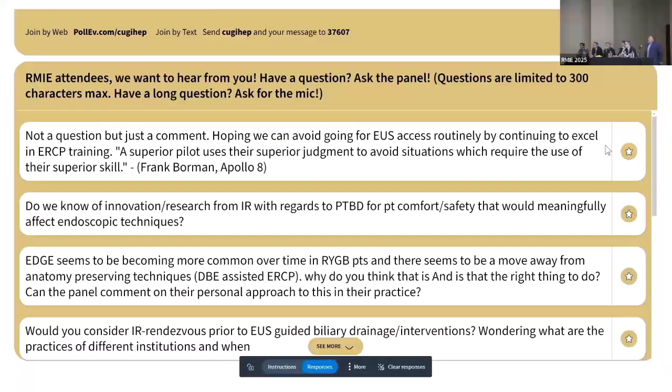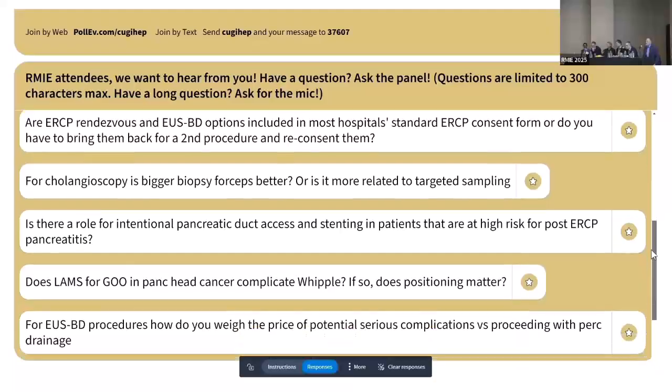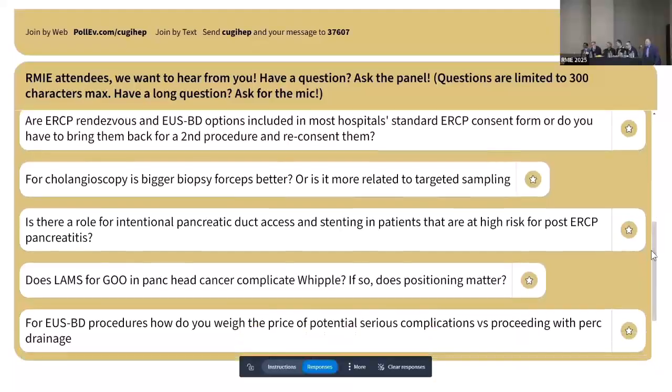You had a question? Yeah. I had two questions. One for Dr. Knoll, since we have a surgical opinion here: for a lot of these altered anatomy cases, on the surgical side, what is being done in the thought process of trying to standardize some of these limbs or document how long these limbs may be? As someone that does altered anatomy ERCPs, and since surgery is also altering the anatomy, maybe something can be done on the surgical side.